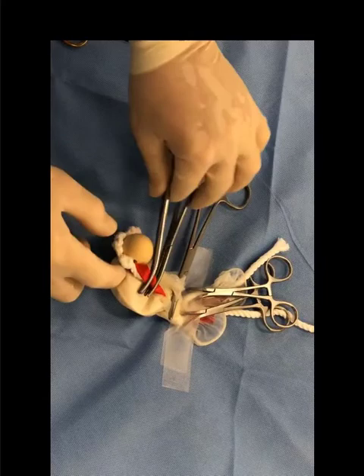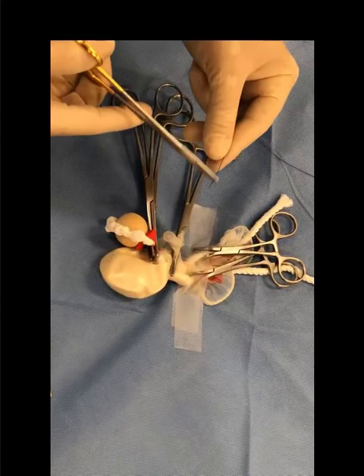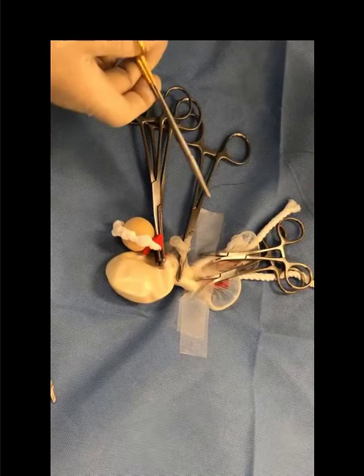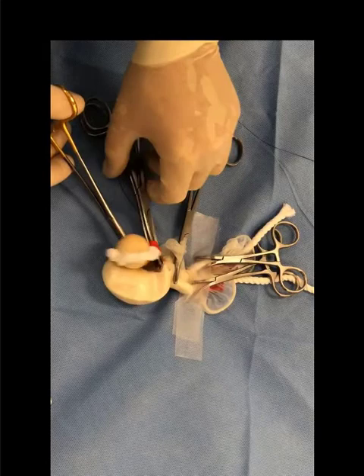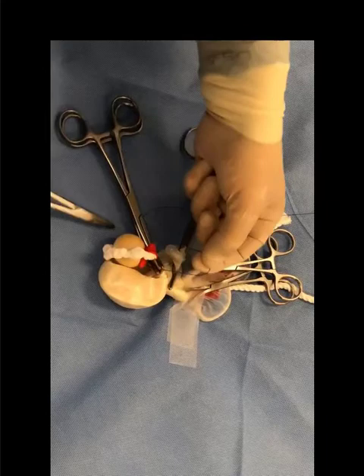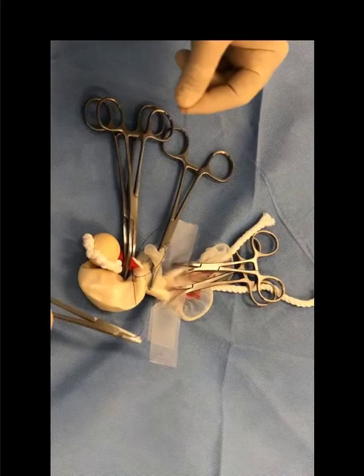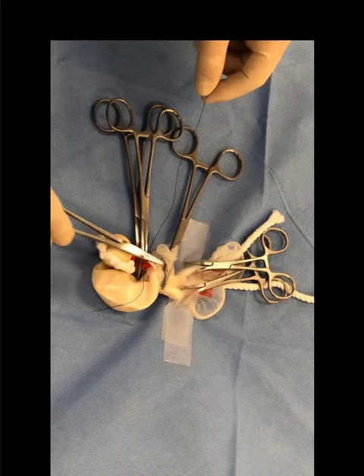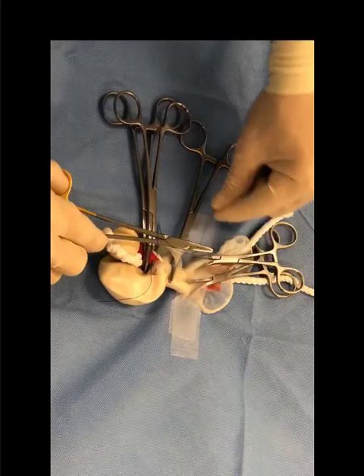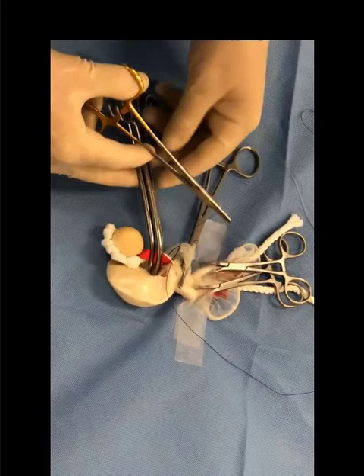Once we're there we can pass our suture material. The first knot we're going to do is an encircling knot — in this case a modified Miller's knot. I generally like to start from cranial, come underneath the hemostats, come behind the pedicle, come underneath the clamps, leaving a loop, and then come all the way around the back. So now we've been around twice — I have the needle end here, the free end here, and a loop that forms in the middle. I put my needle drivers through the loop from caudal to cranial, do a single throw, and then grab the free end and bring it towards me laterally. This is the strangle knot — very good for vascular pedicles because it remains tight as we put tension on.